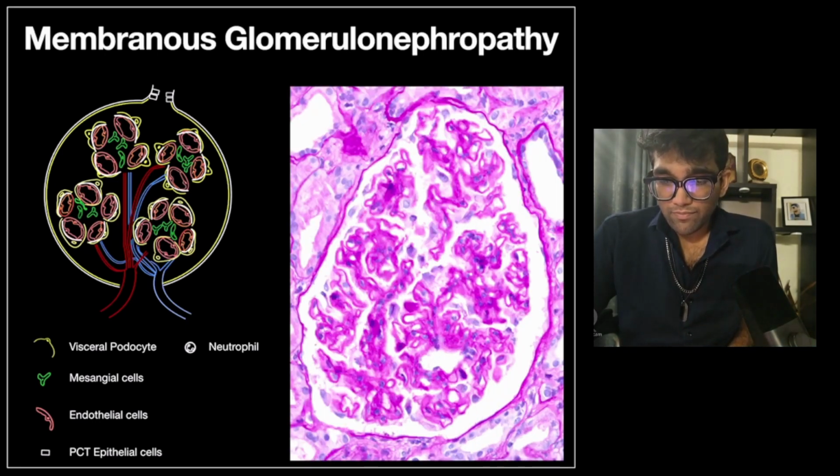So now, how is this different from the histomorphology of the normal glomerulus that we saw? You can see that I can almost trace out the basement membrane here, but in the other image I couldn't really do that. So the basement membrane is very thickened. We discussed already how membranous GN is due to a subepithelial deposition of antigen-antibody complexes, and how that results in changes that we've discussed in detail. So this is the expected morphology.